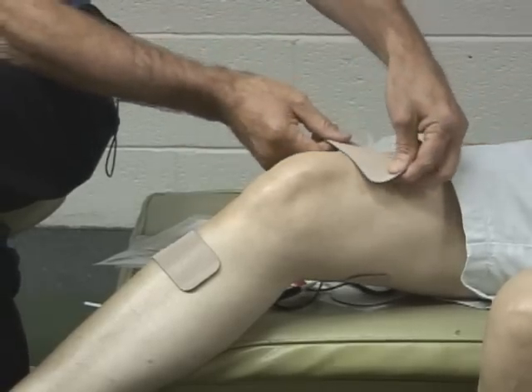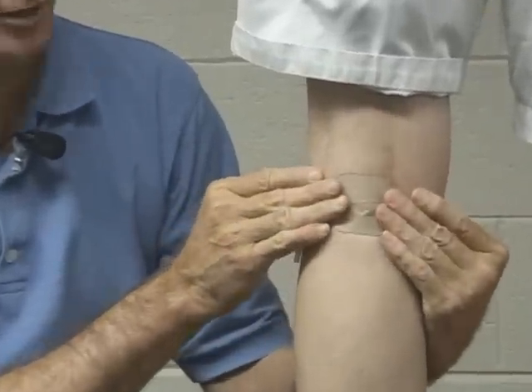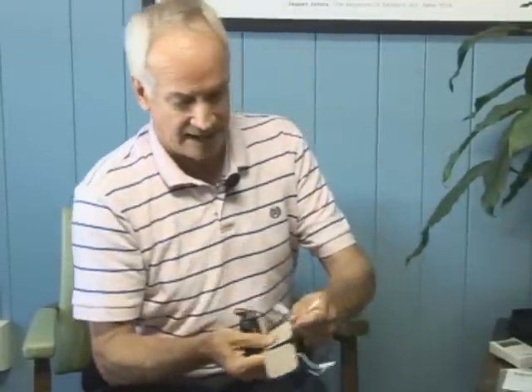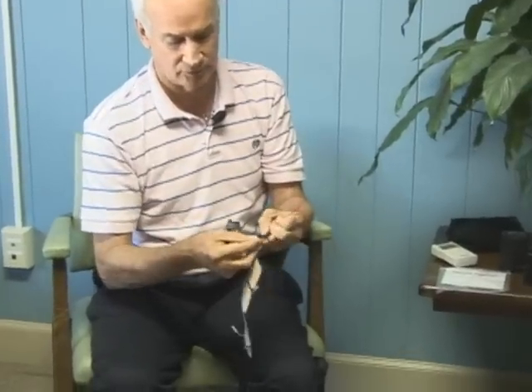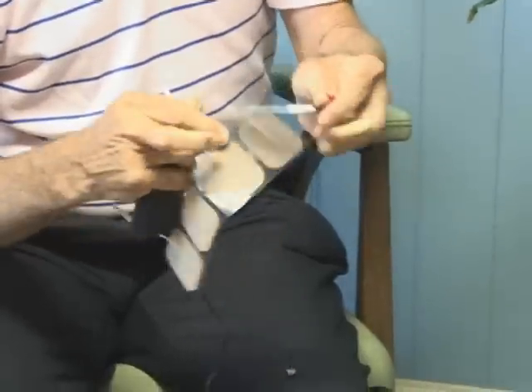Then you will have an electrode system. An electrode — and we have another video on electrode placement explaining where you put electrodes so you don't have pain. I'm going to open some electrodes. I would take the end of my cable and plug it into an electrode — put one here and one here.